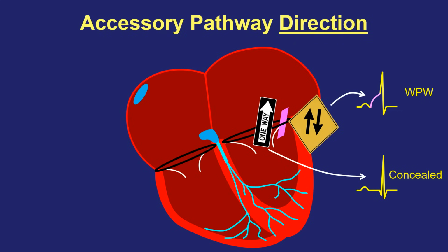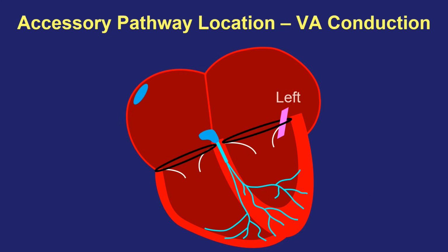And so when you have an SVT study in the adult population, or in the pediatric population as well, you also have to ask the question, once you prove that there is no accessory pathway present in the forward direction, does this person have a pathway in the retrograde direction? Because the most common pattern of AVRT, as we discussed at the beginning, is ORT, orthodromic, down the AV node in His-Purkinje system and backwards up an accessory pathway. So a concealed accessory pathway is perfectly capable of resulting in SVT, just as an overt bidirectional accessory pathway is able to.